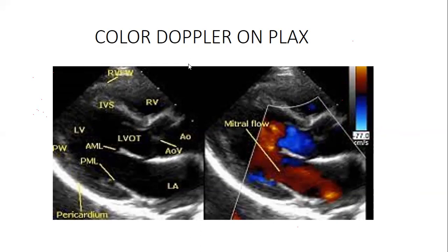Okay, I want people to participate. Rachel, what structure is this where I'm pointing? What territory is this? The left ventricle. It's a left ventricle. Thank you.